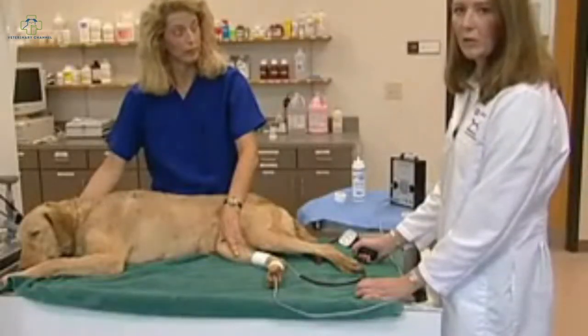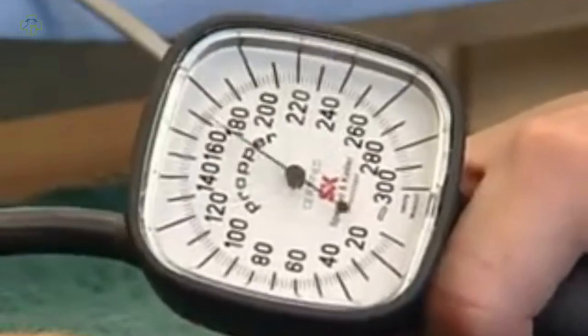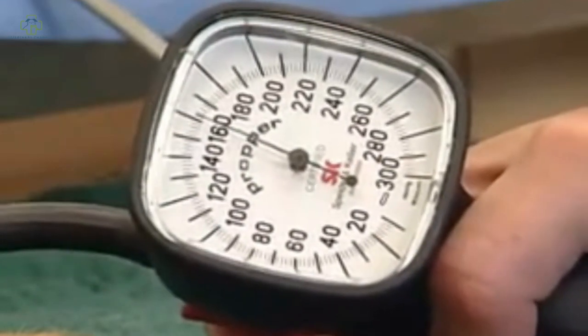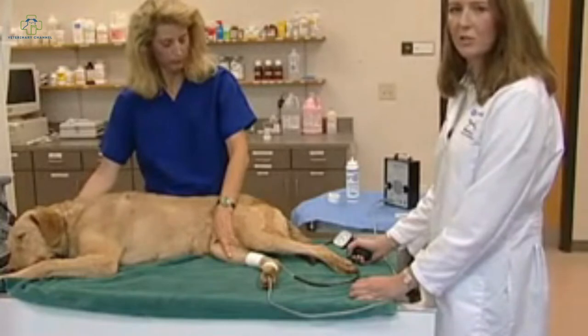Once we have obtained one reading, we go ahead and repeat the measurement, allowing the dog about 30 seconds between measurements. It's also important to allow the cuff to completely deflate between measurements. Again, we inflate the cuff past the point where the sound disappears, then slowly deflate it by releasing the red button. The sound came back at around 118 millimeters of mercury. We usually repeat this measurement at least five to ten times to get an average reading, discarding any outliers. It's also important to record all measurements in the medical record along with the cuff size used and the place of blood pressure measurement for future reference.